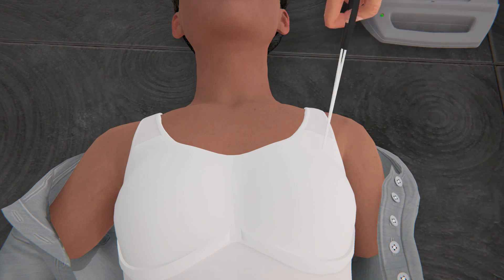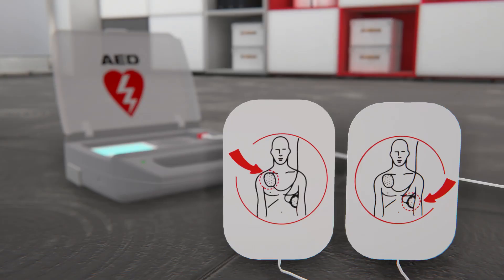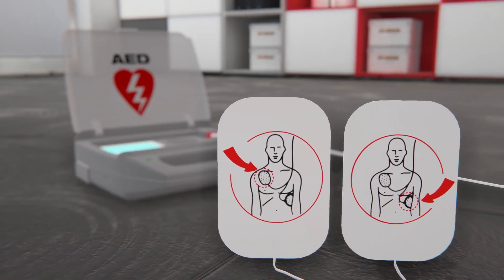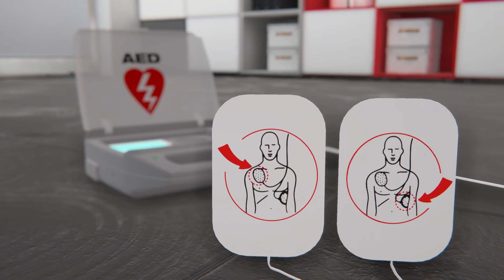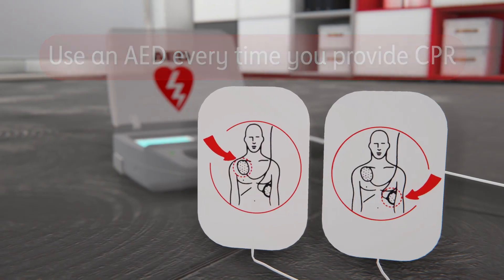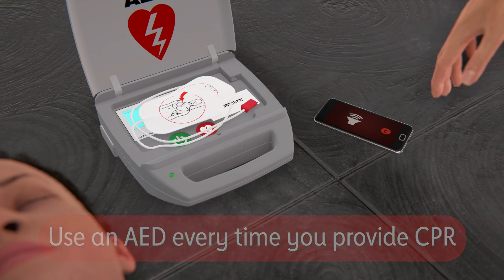You must remove all clothes that cover the chest, as AED pads must not be placed over any clothing or jewelry. CPR combined with using an AED — automated external defibrillator — provides the best chance of saving a life. AEDs are safe, accurate, and easy to use.